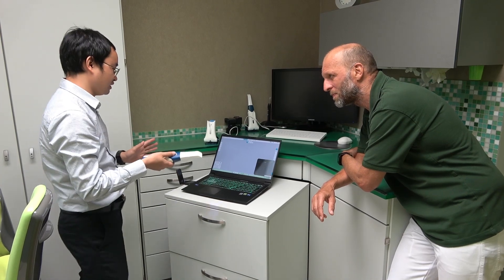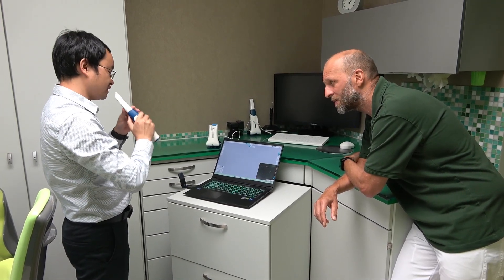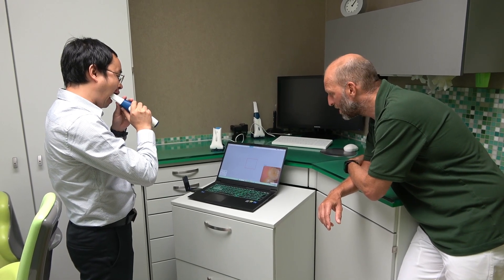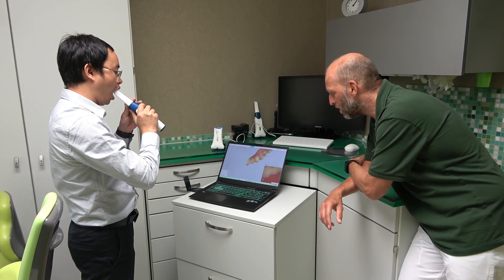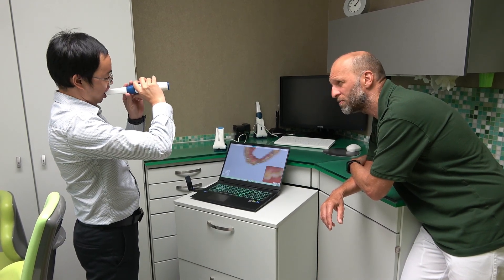Now I scan — before it falls down, the scanner... It's a super speed. Impressive speed.